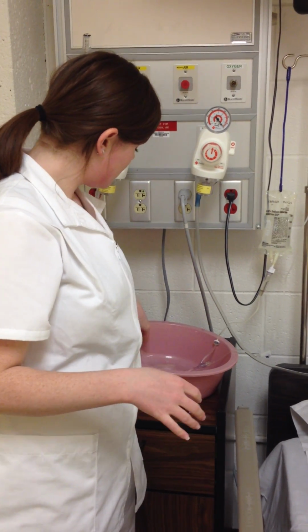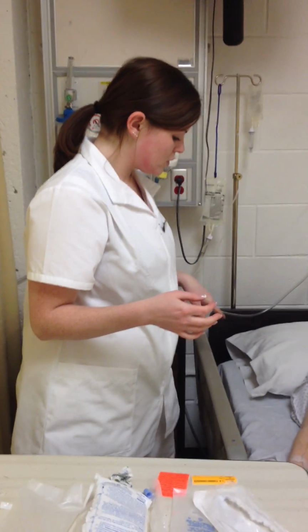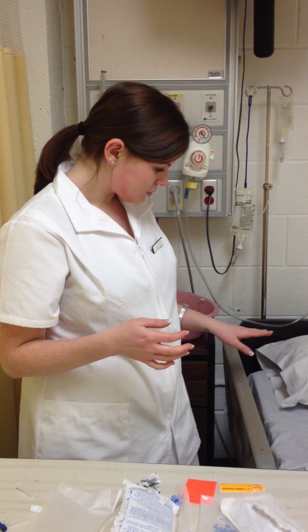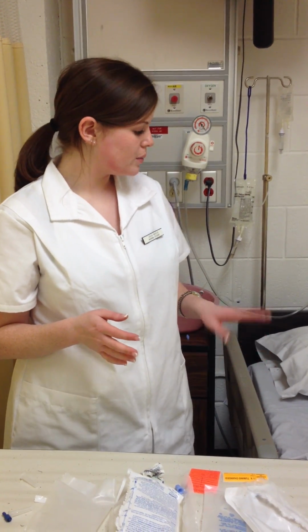And then I'm going to remove my gloves. I'm going to wash my hands again. And then I'm going to put the bed down and make the patient comfortable. I'm going to put the call bell button in reach. And I'm going to leave the patient for half an hour. And then after that, I'm going to come back.